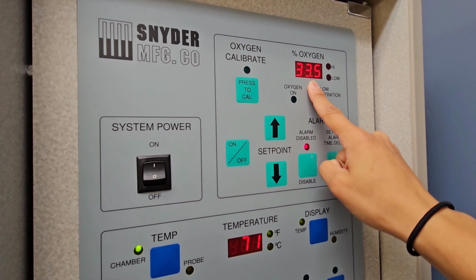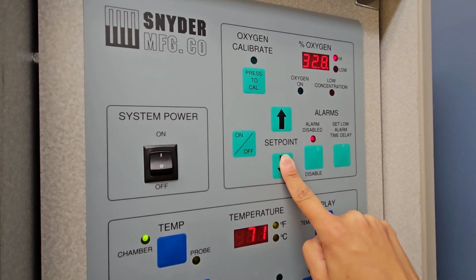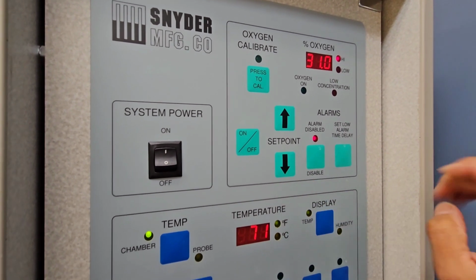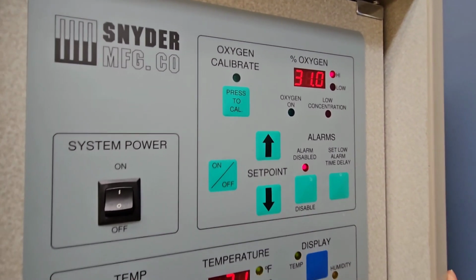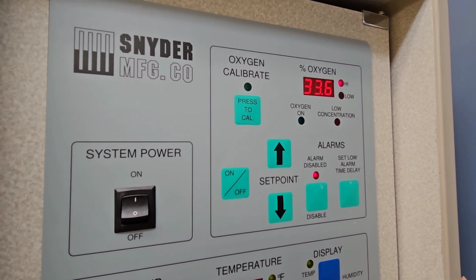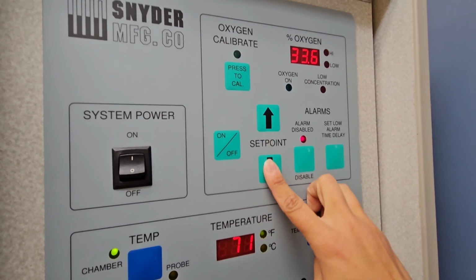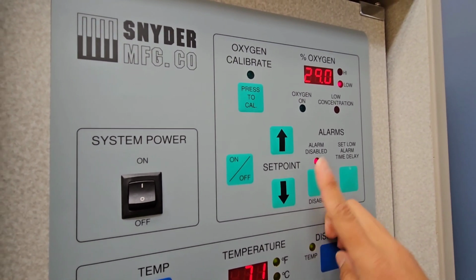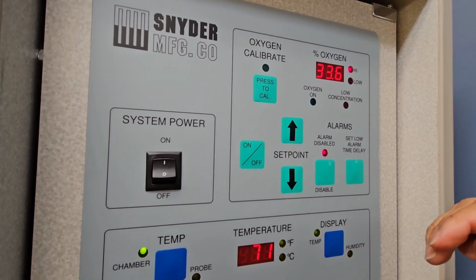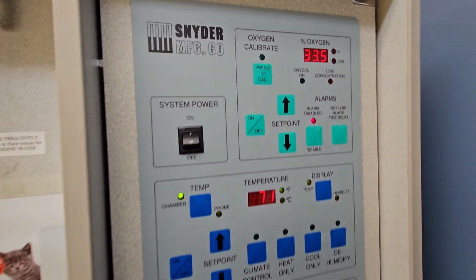So the upper level is 33. I'm going to hit this up button that shows me 33, and I'm going to lower it. I'm going to hold this down until it gets down to 31, and I'm going to let go, and then it is going to flash back. Now it's going to tell me that's our current level of oxygen. Now, if I hit this low button, it'll tell me 29 because the high level is slowly coming down to 31. So that is how you would decrease the percentage of oxygen.